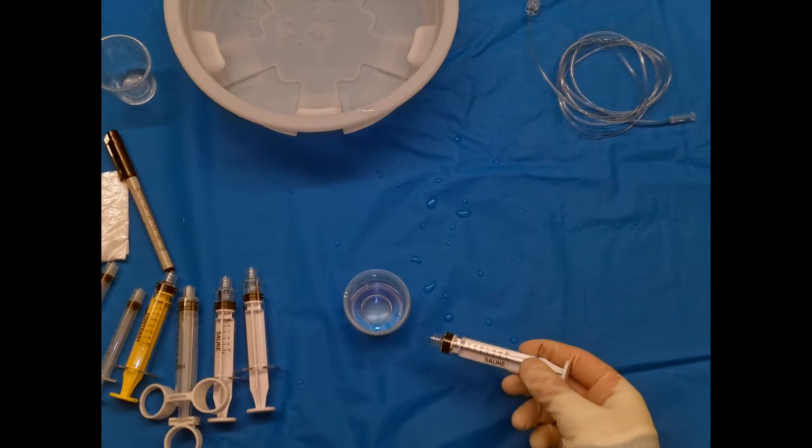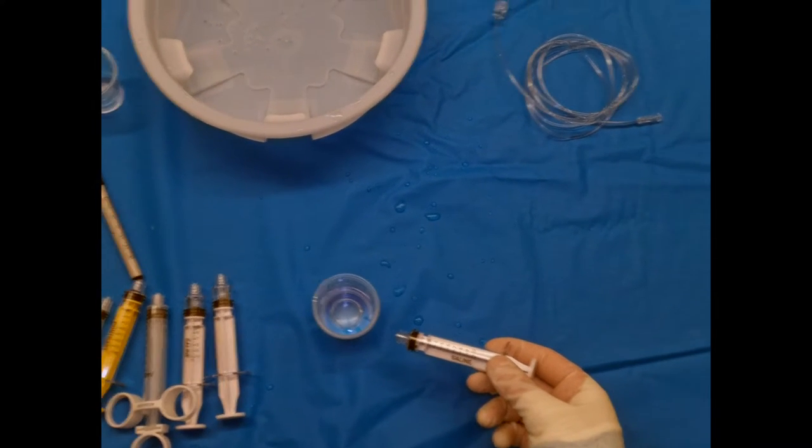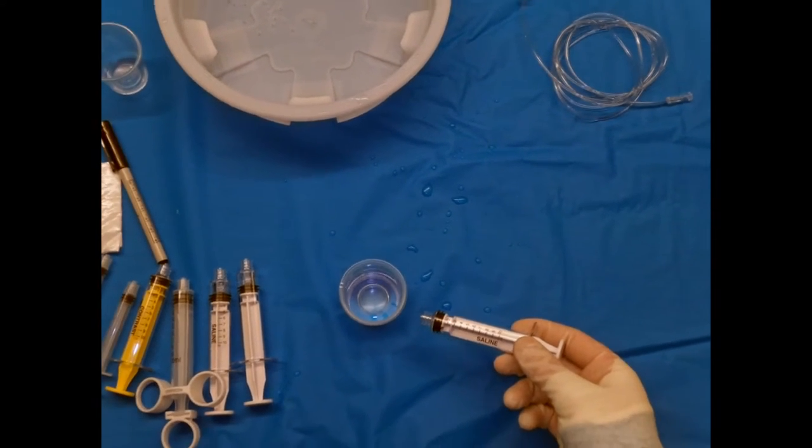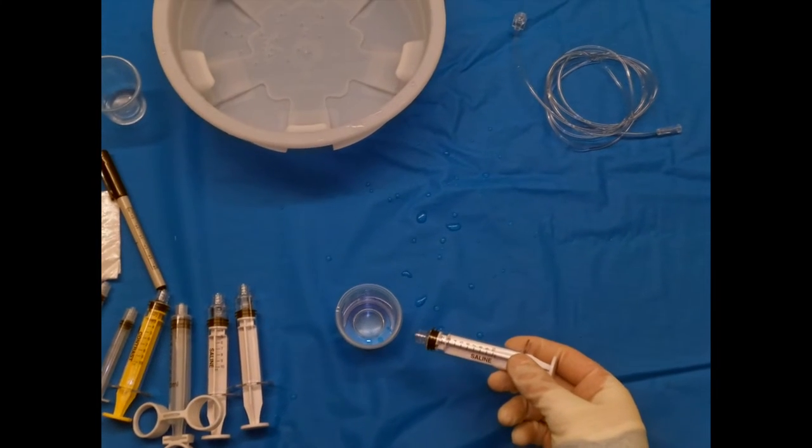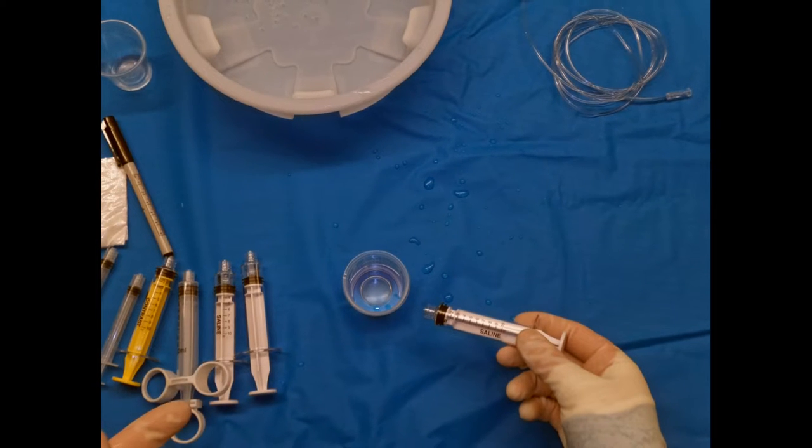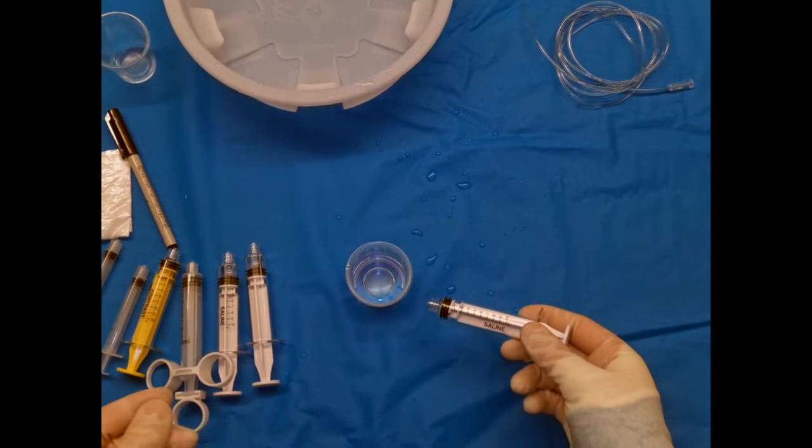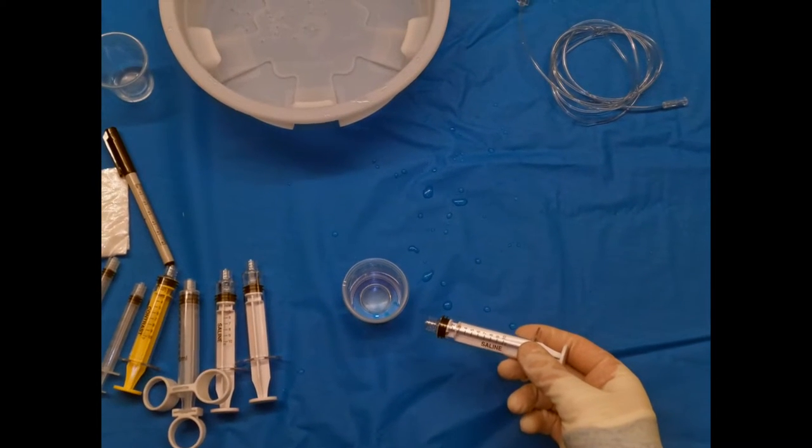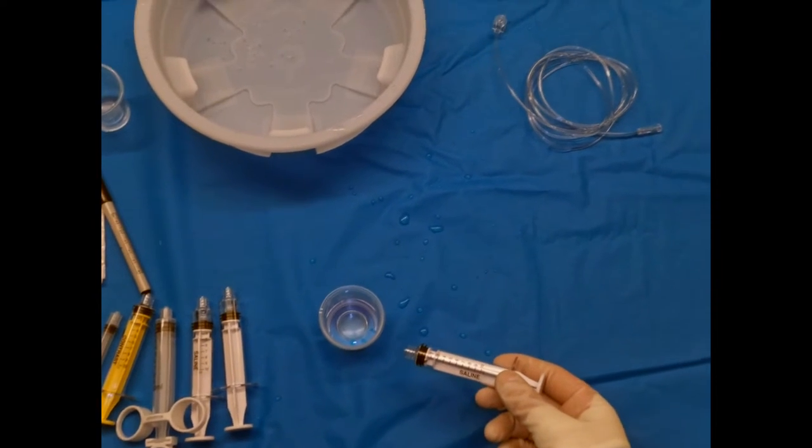The base principle here when you're drawing up anything in neuro-IR is that you don't want to introduce any air. Any air that is introduced you want to get out, and you always want to leave room for you to pull back on the syringe to remove air from a second system that you're working with.